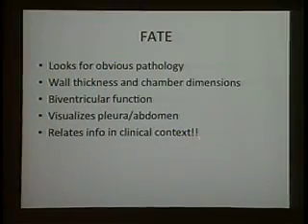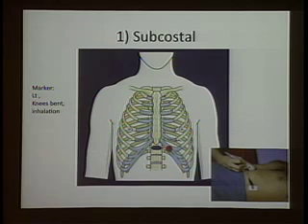Okay, and again, we're going to review the extended views in another lecture. And again, it's pattern recognition. You have a question, and the images should be able to answer those questions, and they have to be done in the clinical context.